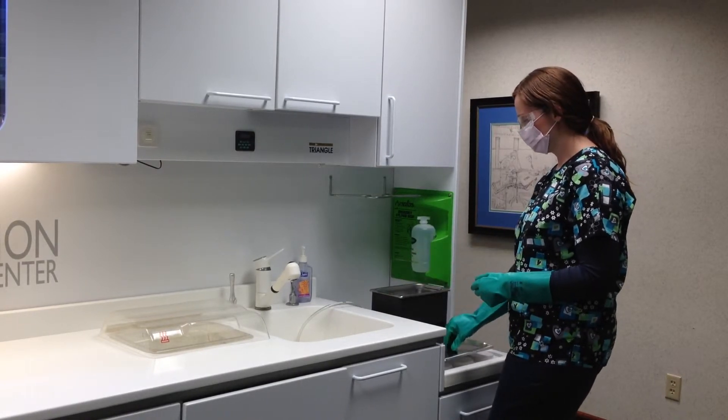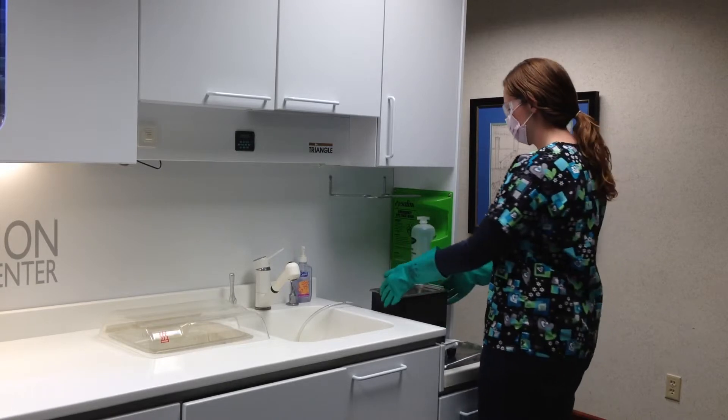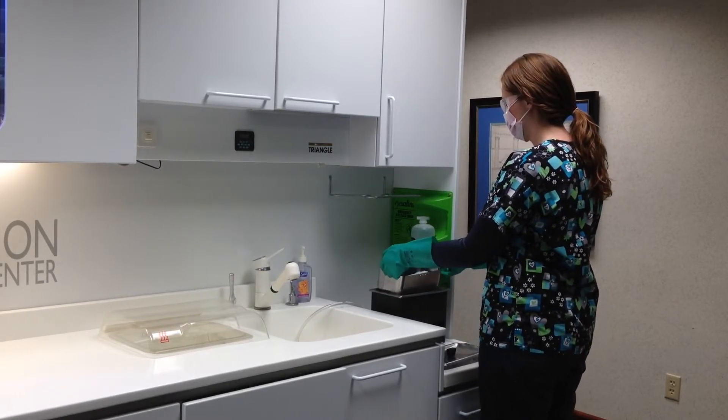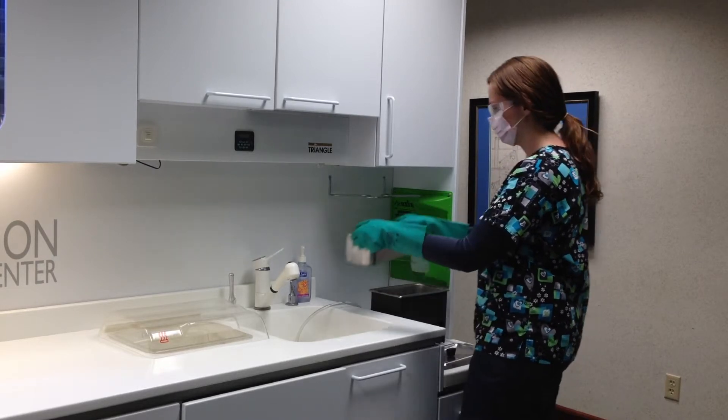This does not disinfect instruments. Keep in mind that this is highly contaminated. The unit is covered when it's in use to reduce the spatter or any contaminated aerosols.